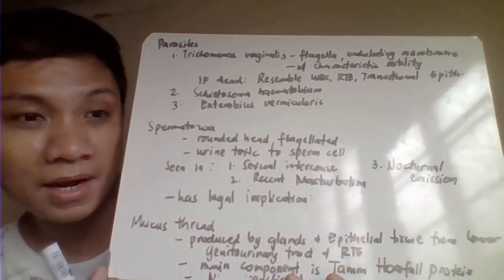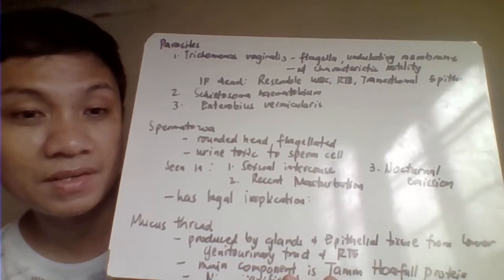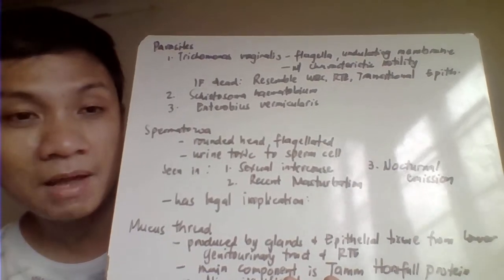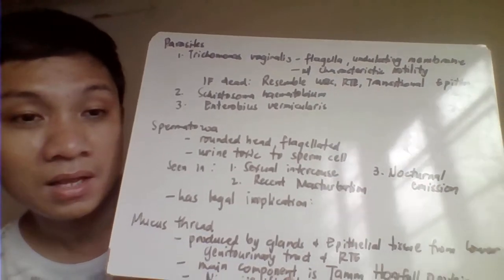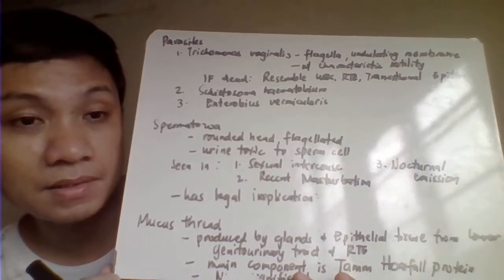But most likely, if the urine sample has been contaminated by seminal fluid, when we test it with the reagent strip for protein, it will give a positive result.